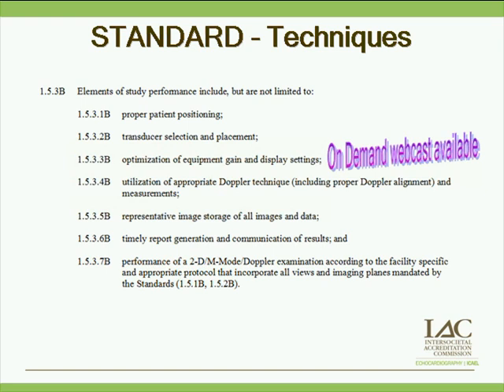Elements of the study performance: proper patient positioning, transducer selection and placement, optimization of equipment and gain settings.